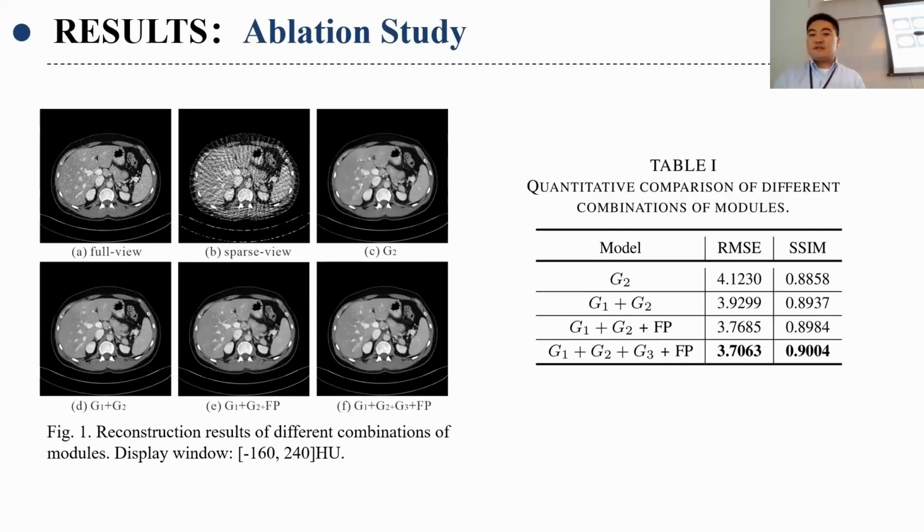Experiment 1 is similar to the basic deep learning based Sparse-view CT reconstruction algorithm, which uses an image domain network to remove the noise and artifacts in the image reconstructed with FBP. Experiment 2 used both projection domain network and image domain network, which is consistent with the primal mapping in CR-Recon.